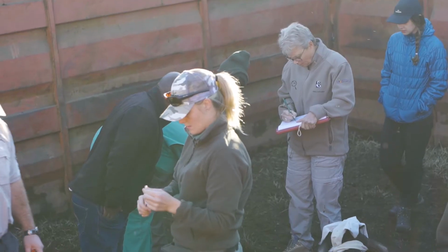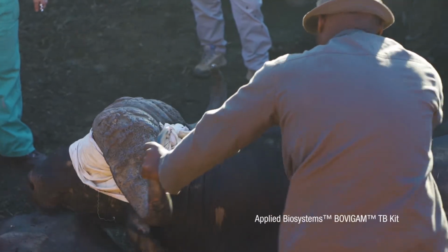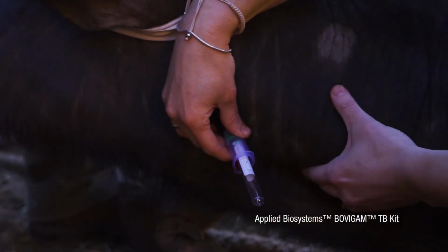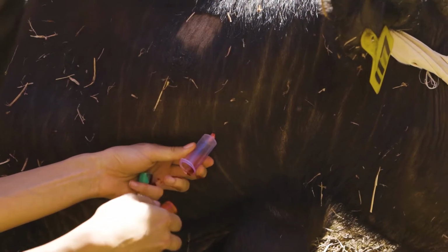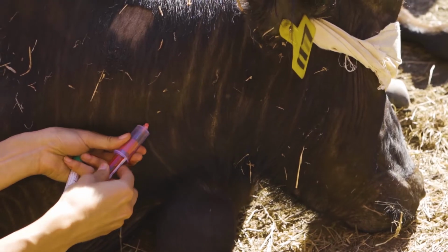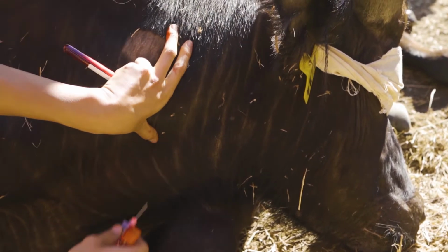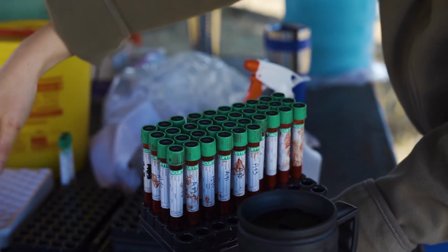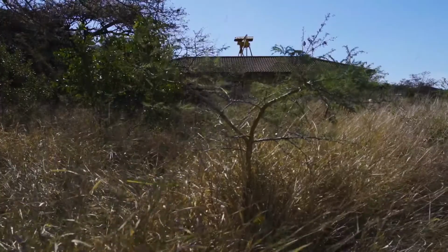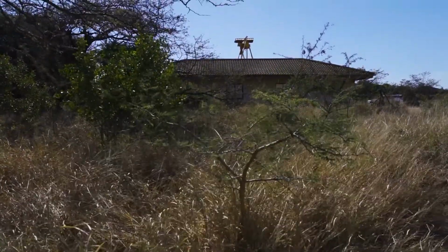The testing that we do for screening for tuberculosis in the buffalo herd is that each year during our winter, the cooler part of the year, the animals are tested in a different part of the park. We perform the actual BOVIGAM tests, or the blood-based tests, here in the park. We have a team that comes here, sets up a mobile laboratory. We take the blood samples from the buffalo in the field, immediately transport them to our small laboratory. And because of the robustness of the test and its ease in performing the test, we can actually do it right on site and get an answer for the managers and the veterinarians within 2 days.